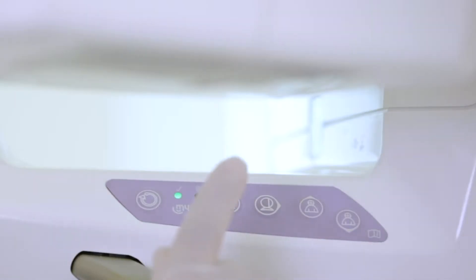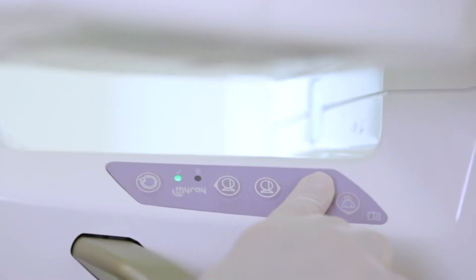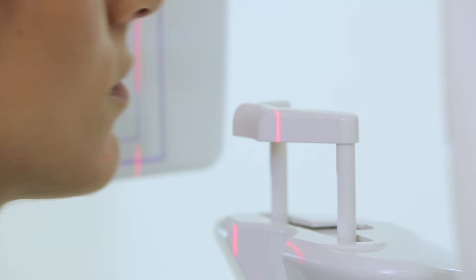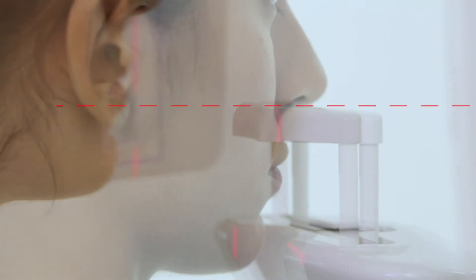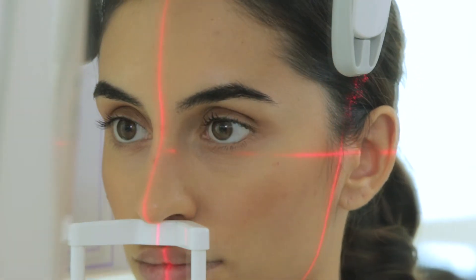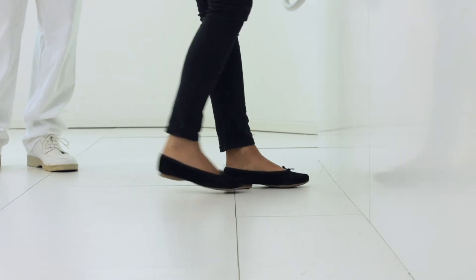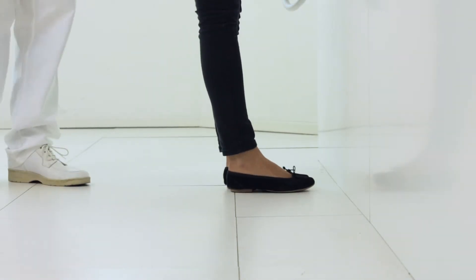The first operation adjusts the height of the device. This is done from an onboard keypad. The subnasal support must be at the same height as the base of the nose. Once the correct height has been reached, the patient places her nose on the subnasal support and feet slightly forward with respect to her pelvis.